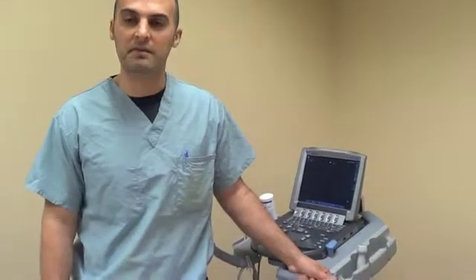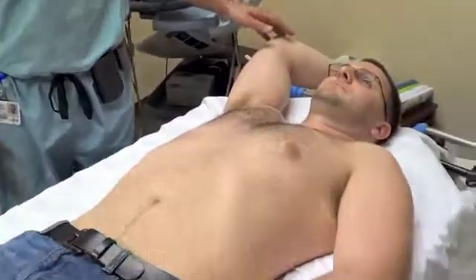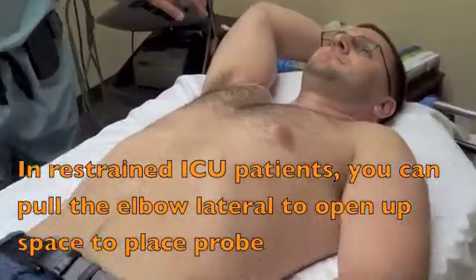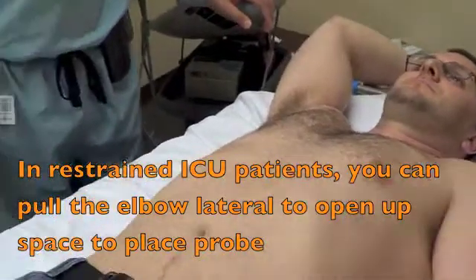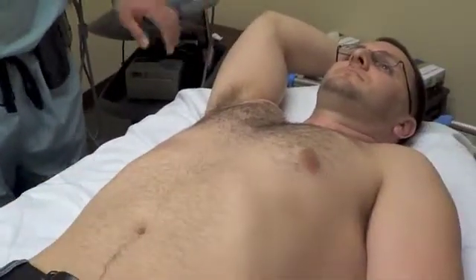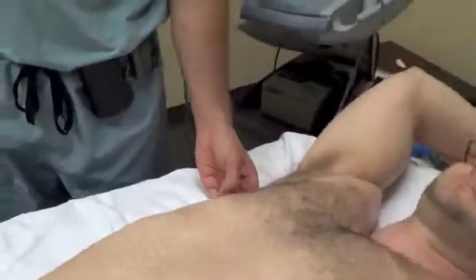The next part would be to take a look at the posterior part of the chest to identify any consolidations or effusions. Typically, this would be done by having the patient put his arm up. You would also identify the PLAPS point, which is almost posterior — it's going to be lateral to the scapula.